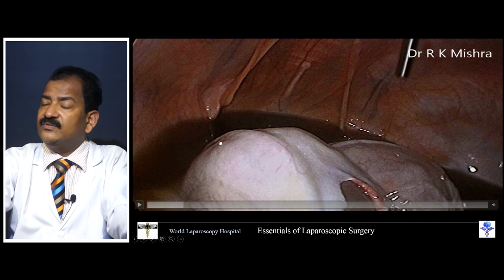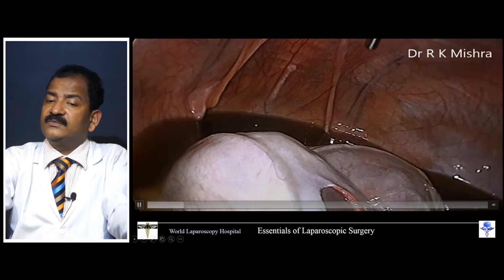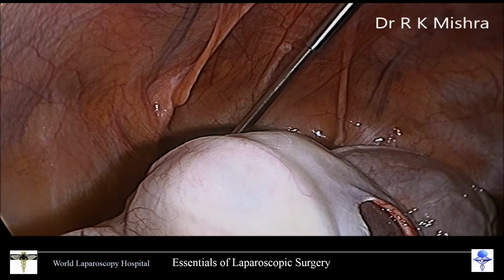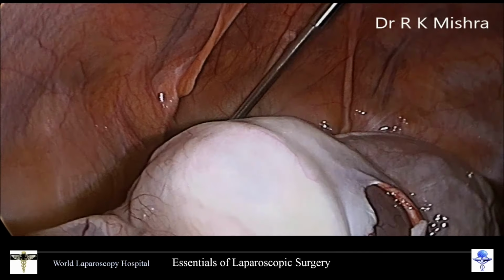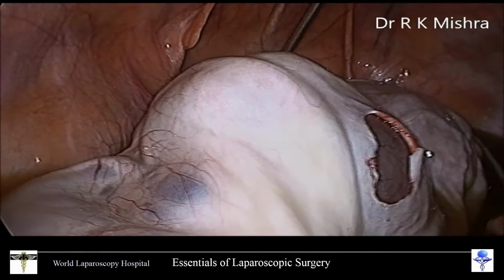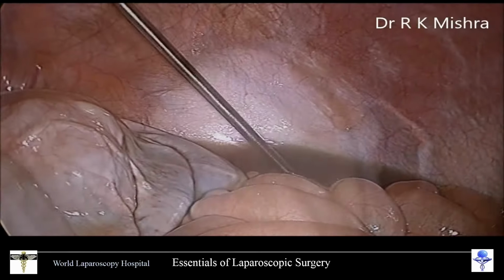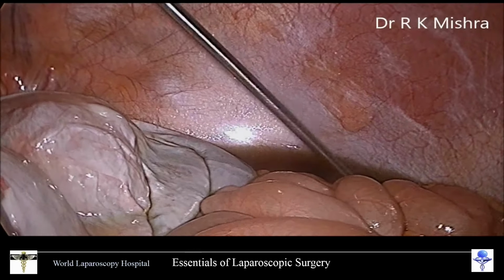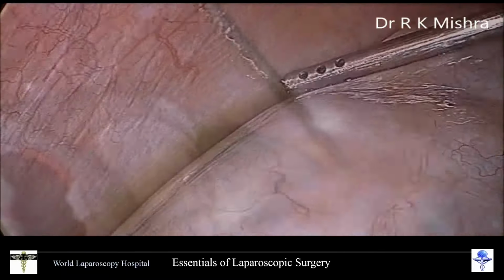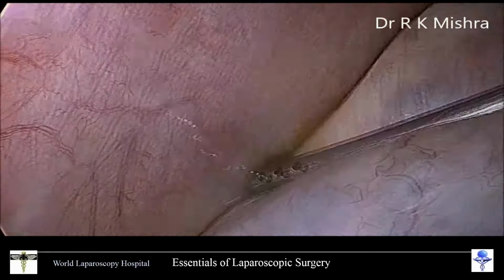The anterior cul-de-sac is filled with fluid. So first you have to aspirate everywhere and suck all the fluid out. Later you have to do copious lavage also, to clean it multiple times.